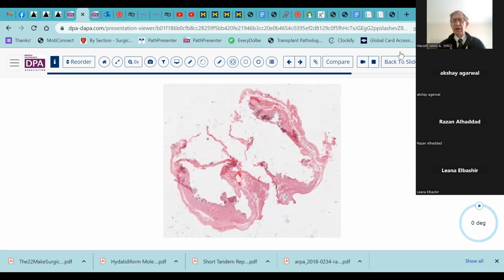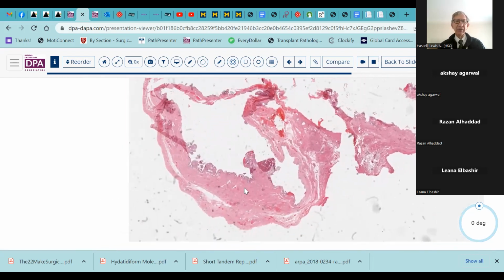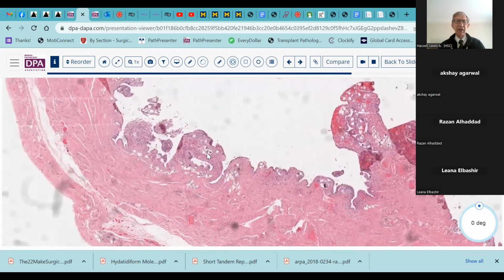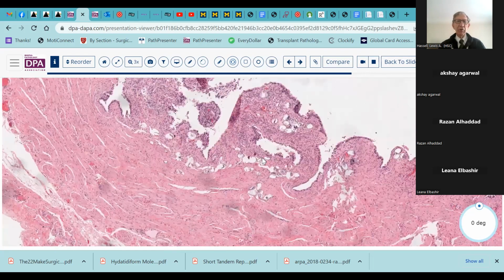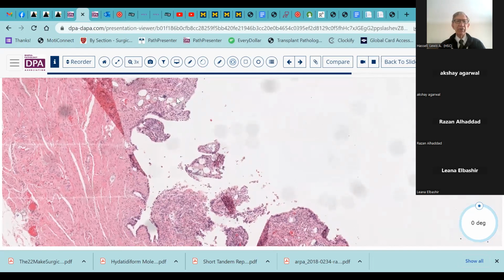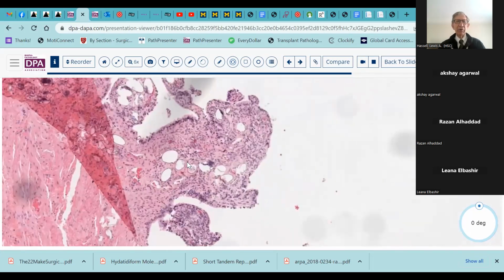Okay, so here's another little case here, and I think this is also listed as a chronic salpingitis, but you can see it has a very different configuration here. We don't have that intense inflammatory process. And so if you previewed this case, you probably picked up that there's sort of an indolent inflammatory process.